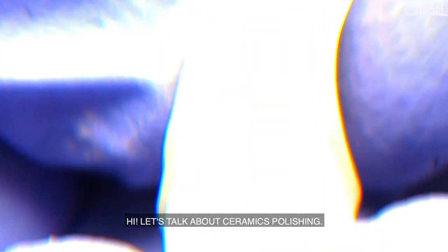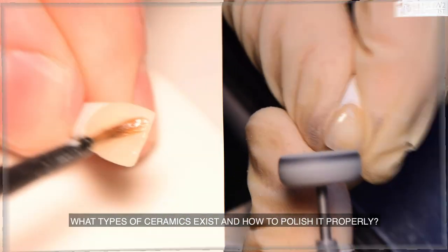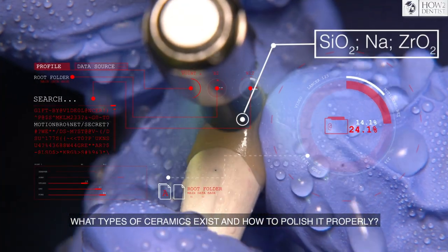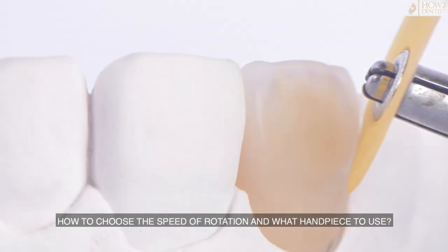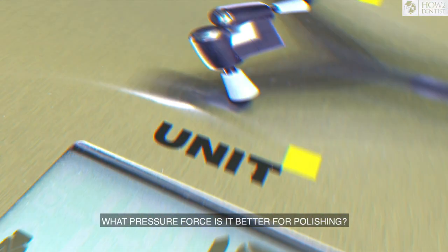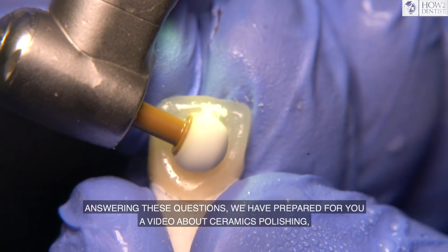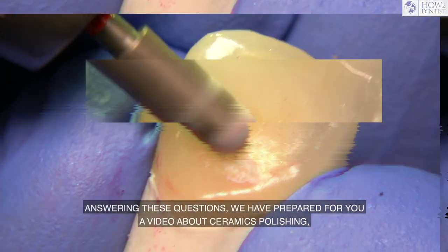Hi, let's talk about ceramics polishing. Are we interested to polish or to glaze? What types of ceramics exist and how to polish it properly? How to choose the speed of rotation? What handpiece to use? What pressure force is better for polishing? Answering these questions, we have prepared for you a video about ceramics polishing.